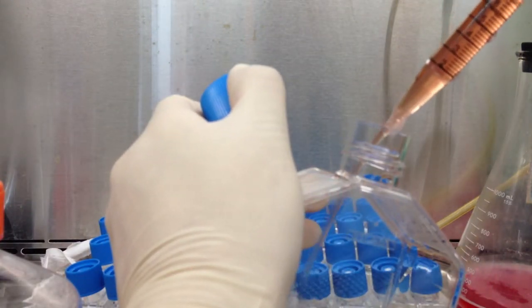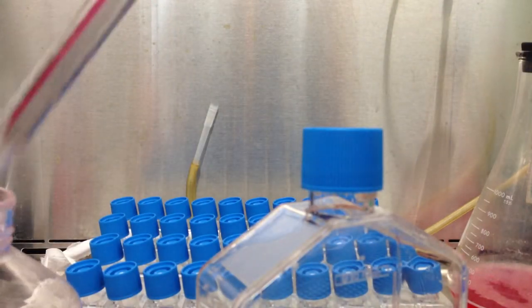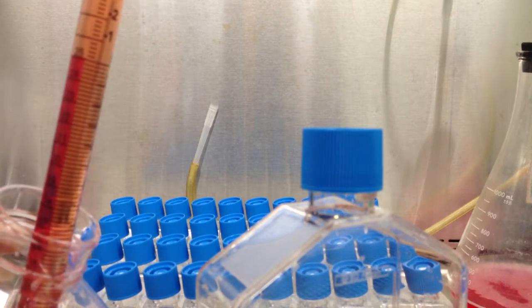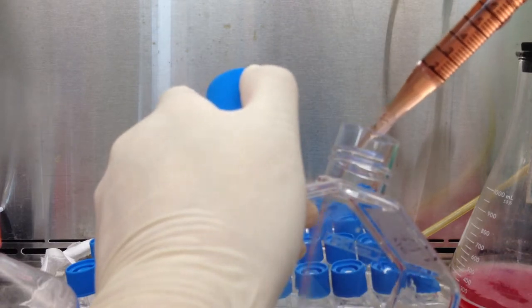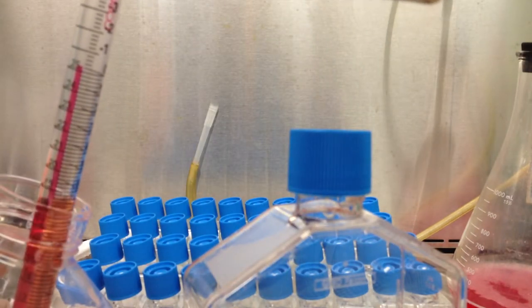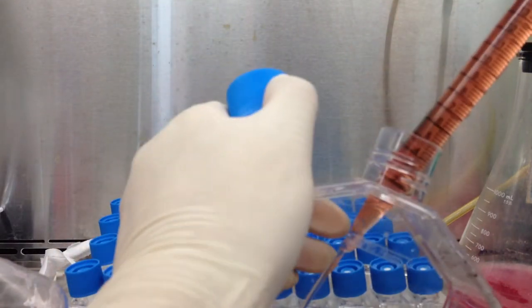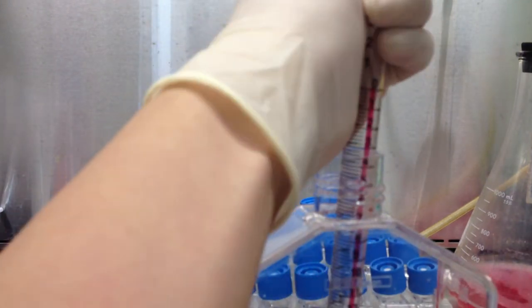I usually add a little more than 30, usually 30.5 or 31 milliliters with every pull. That is 90, okay. Just so that when it bubbles and stuff, I'll have enough to make sure that I can get 5 milliliters. 120. This is, and I don't care about the tip now, this is 150.